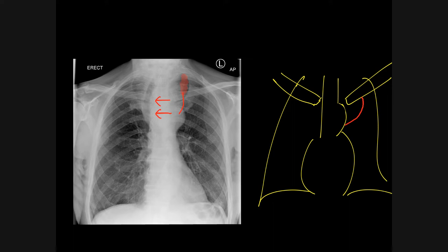This demonstrates the well-defined anterior mediastinal mass lesion below the clavicle and the fading as it goes above the clavicle. On the right hand side you can see that a middle or posterior mediastinal mass is well-defined both above and below the clavicle.